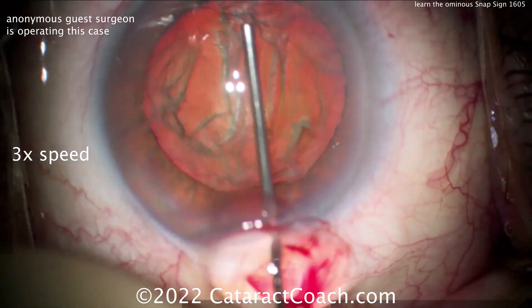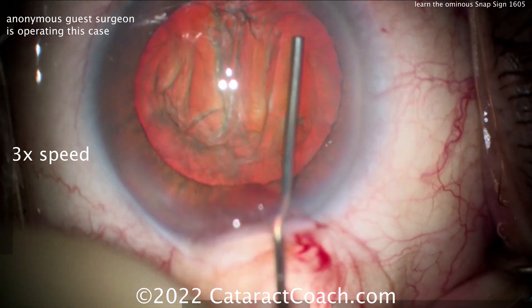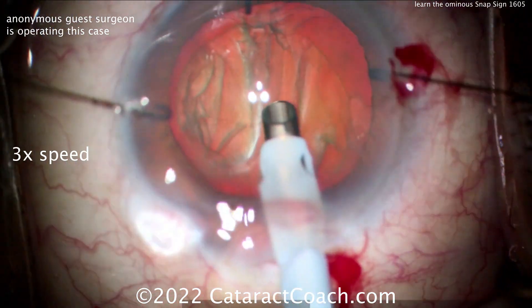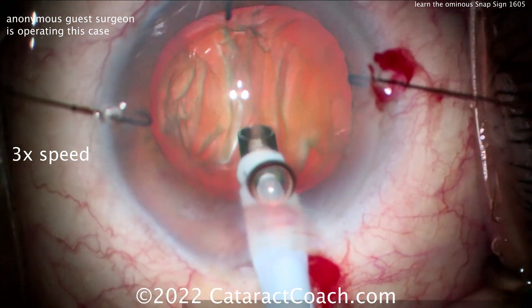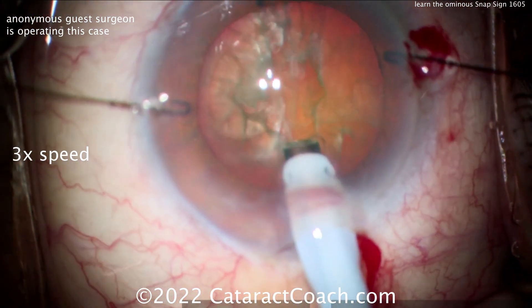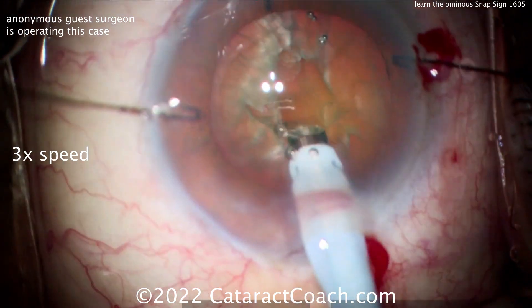Sometimes you inject too much BSS and the cataract comes out of the capsular bag — that's okay. But if you have a very small rhexis, or the cannula like in this case is blocking and preventing the nucleus from coming up, well, then the fluid has to be released somewhere and it blows out the posterior capsule.